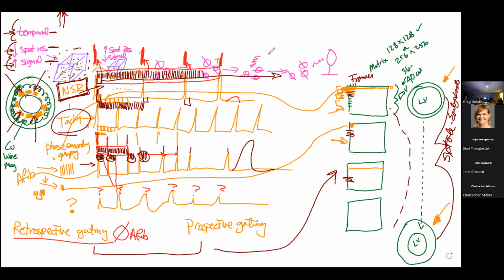The way that algorithm works, when the scanner is looking for the trigger, it could look for the amplitude of this R wave. It could look for the slope of the upstroke. It could look for the frequency of it.